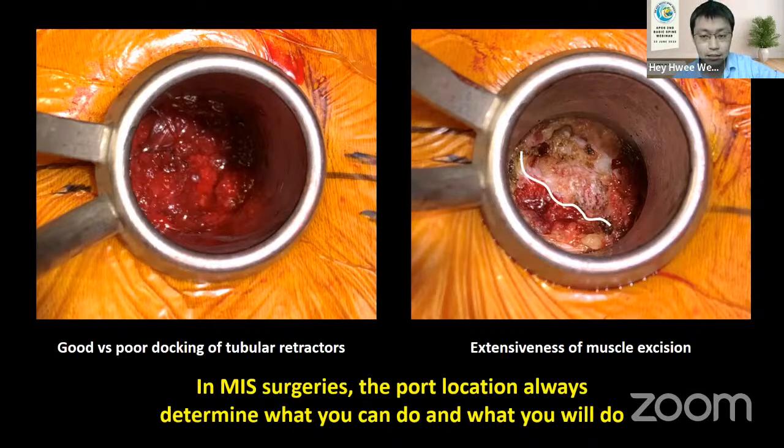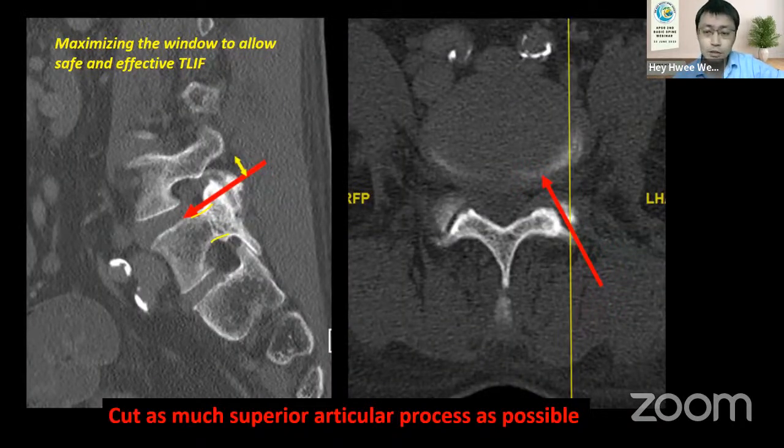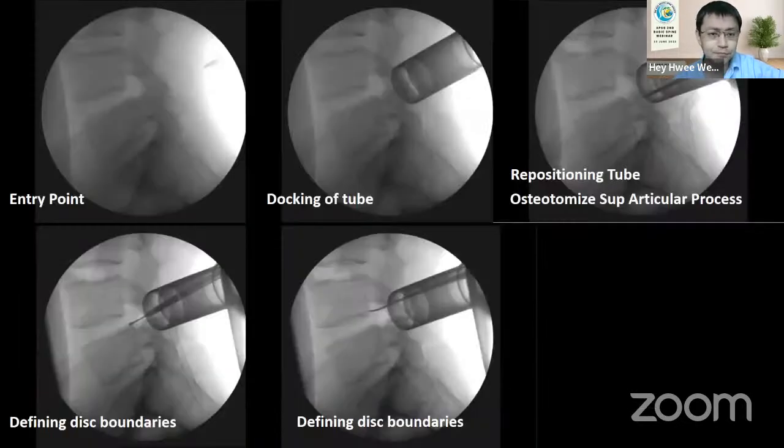And remember what I said, the direction of the port determines what you would do finally as you enter. So this is the joint line. If you dock at the facet joint, you appreciate that if you go along the joint line by resecting the SAP, preserving the IAP, whether you will hit the traversing nerve root or not. And I would recommend as much resection of the superior articular process as possible. That gives you a wider corridor. So feel where the pedicle of the vertebra below is, and then resect as much SAP as possible.